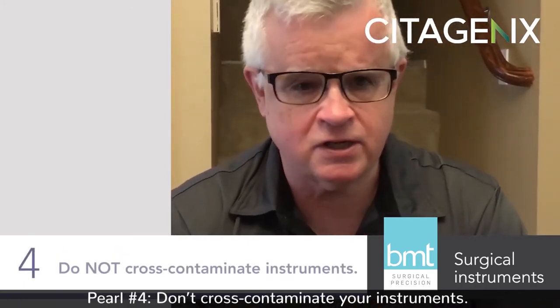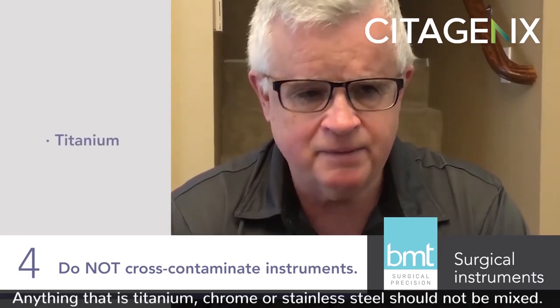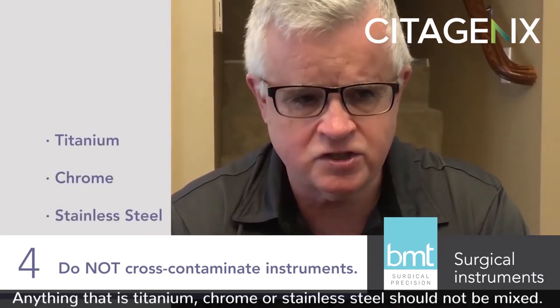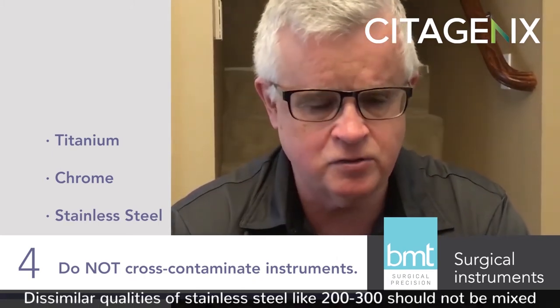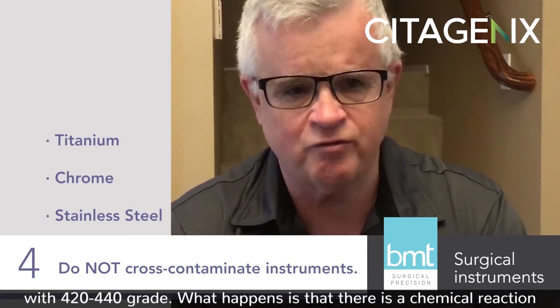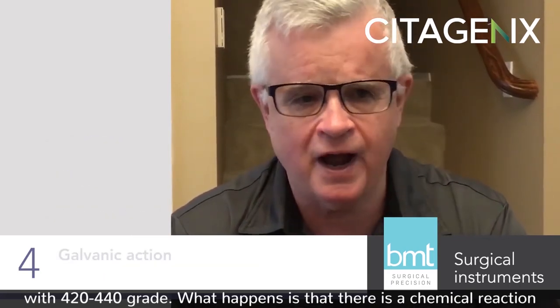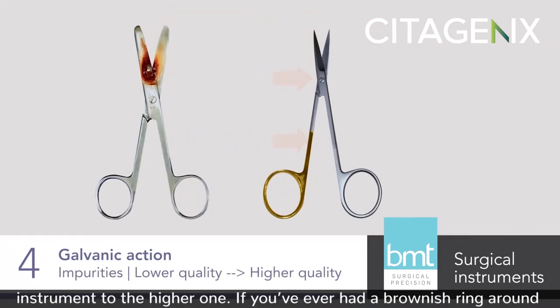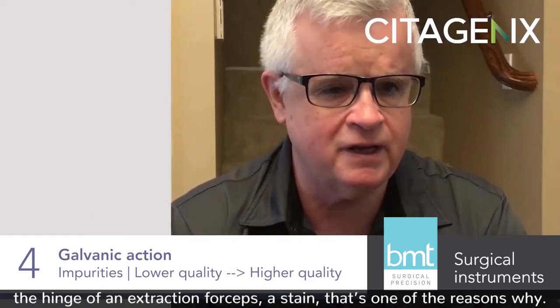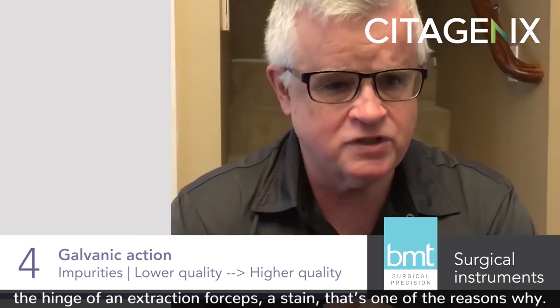Pearl number four: don't cross-contaminate your instruments. Anything that is titanium, chrome, or stainless steel should not be mixed. Dissimilar qualities of stainless steel — like 200-300 grade — should not be mixed with 420-440 grade. What happens is there's a chemical reaction called galvanic action, and impurities will leach out of the lower quality instrument to the higher one. If you've ever had a brownish ring around the hinge of an extraction forcep, a stain, then that's one of the reasons why.